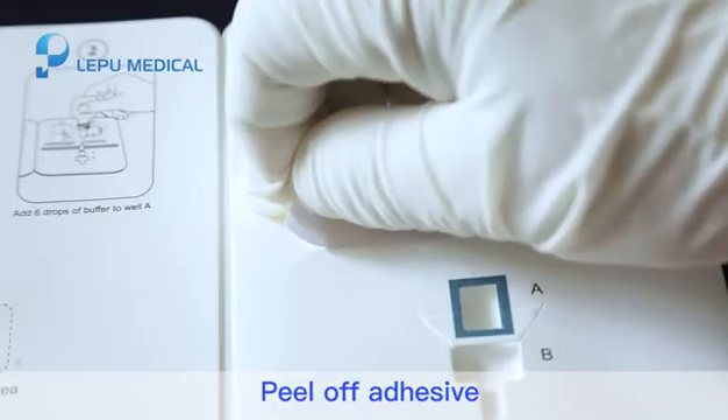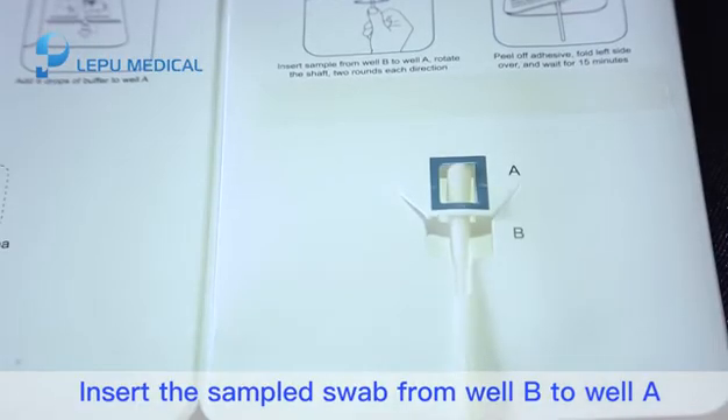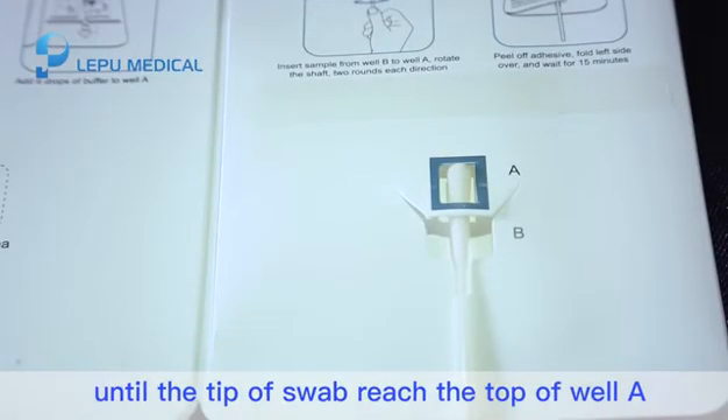Step 4. Peel up the adhesive. Insert the sampled swab from well B to well A until the tip of the swab reaches the top of well A.